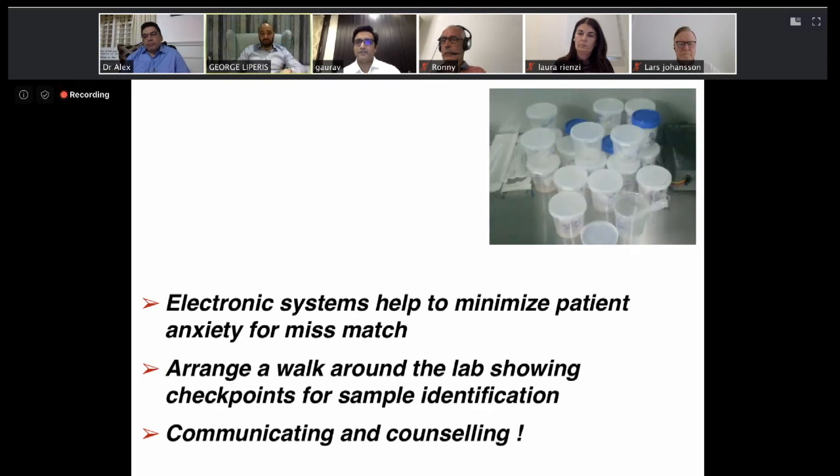Just to add, I mean, everything is very correct. Just to add that also when there is electronic witnessing, there are no distractions for the people performing their individual tasks. So when you're using a double witnessing system, then it could be that at any time someone is focused on their either vitrification or ICSI, and then someone steps out of the lab. And in a busy lab, the turnaround and the witnessing can be such that you have to think what everyone else is doing in terms of the timing. So it can offer you time to fulfill a certain task without distraction and with fewer mistakes, and it can work in a better flow in the workflow.